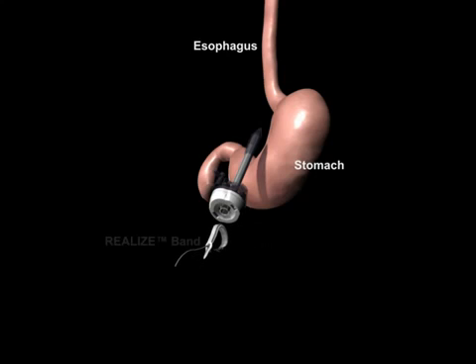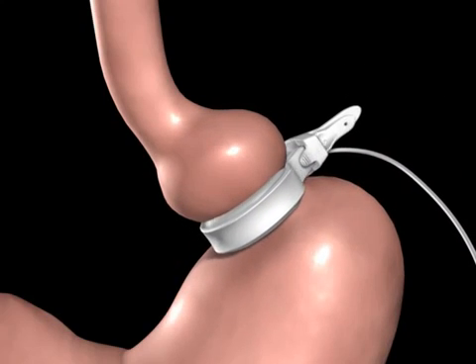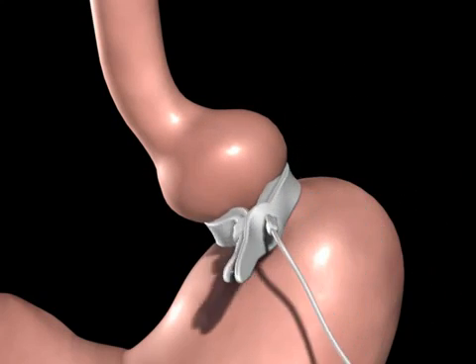The Realize band is introduced to the abdomen through a trocar. The Realize band is positioned around the upper portion of the stomach and then secured using the locking mechanism.